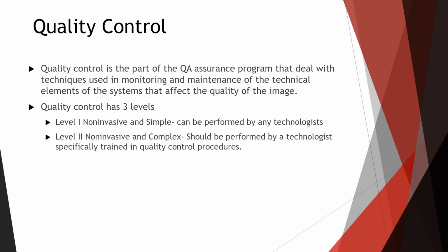Level 2 is non-invasive and complex, should be performed by a technologist specifically trained in quality control procedures. So this would be possibly like more of like monthly tests or weekly tests, more involved processes.